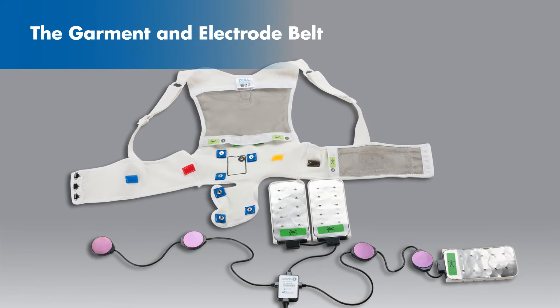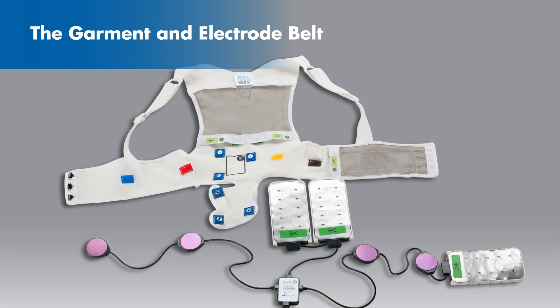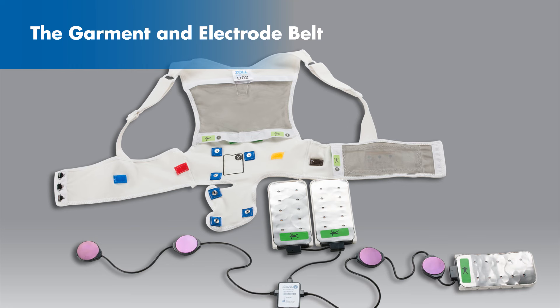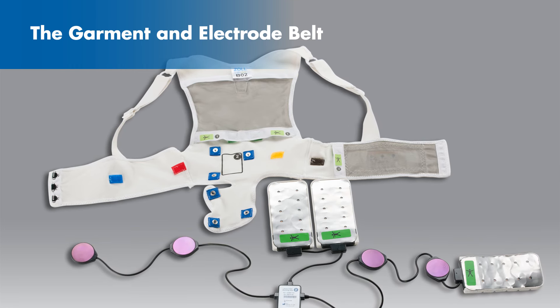Before you begin, lay both the electrode belt and the garment on a flat surface. Lay the garment down with the silver fabric facing upward. Lay the electrode belt next to the garment so that the silver sides of the therapy pads are facing upward as well.